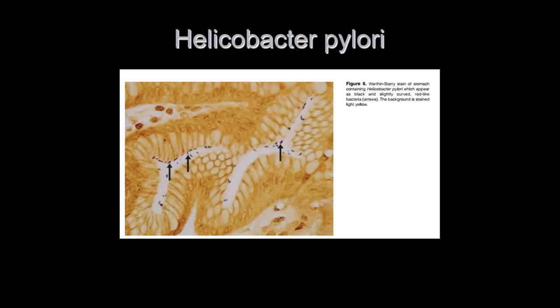What about Helicobacter pylori? We talked about Helicobacter and how Helicobacter can produce a urease enzyme. This is very, very important here in their identification. And so it changes the pH from acidic into alkaline. So you can take a swab from the stomach, and it is very, very important here to look for the urease enzyme for Helicobacter for their identification. Helicobacter pylori.